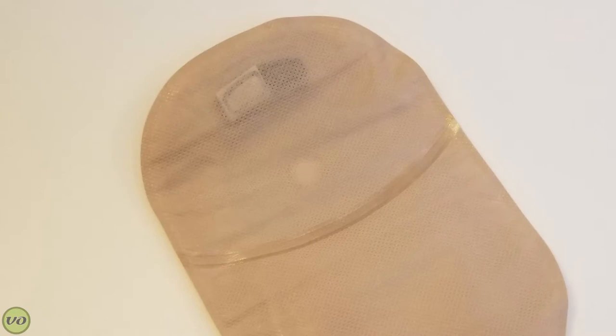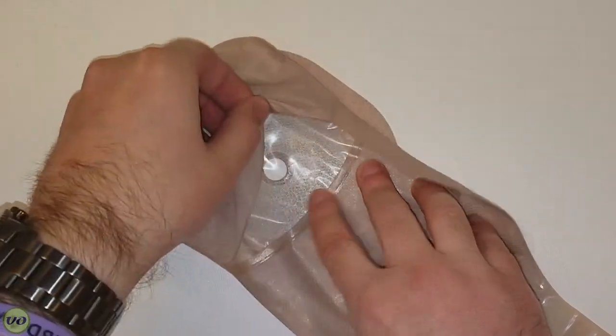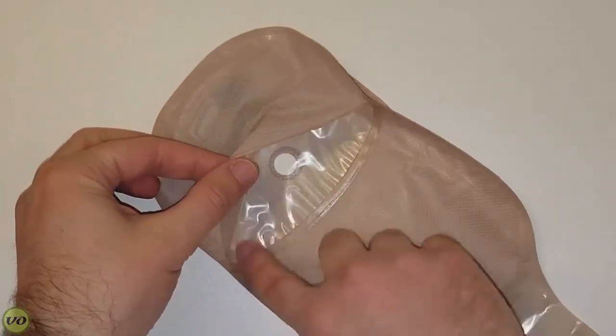An inspection window gives me the opportunity to see inside while also having an opaque cover for concealment. I tend to wear my pouches in a pouch cover or some kind of support garment, so that doesn't matter much to me, but I know a lot of people who aren't wearing those accessories will really appreciate it. Out of the box the inspection window is actually sealed — if you want to use it exactly like the old Premiere you can, but if you want to use the feature, just tear the perforated edge and now it's an inspection window.